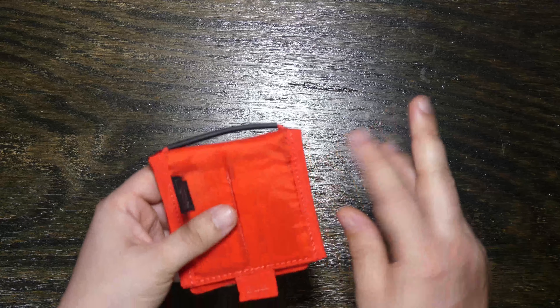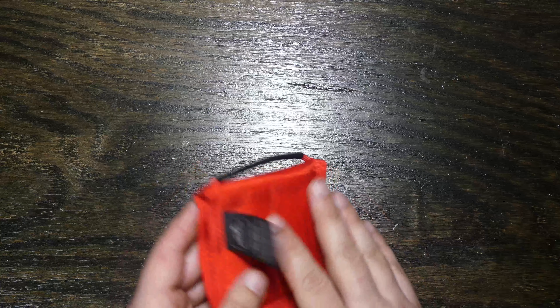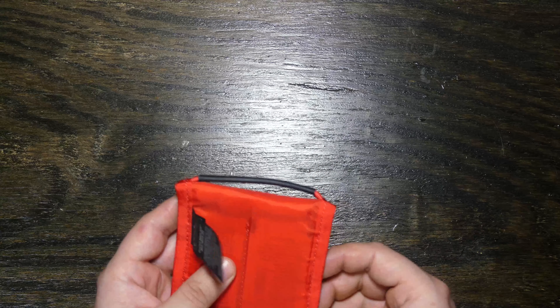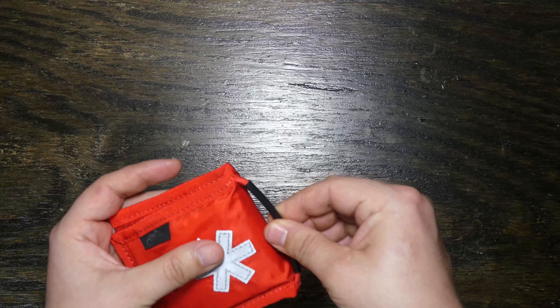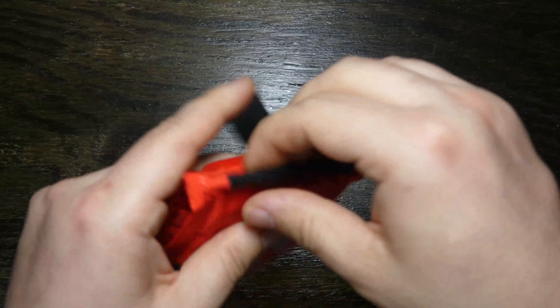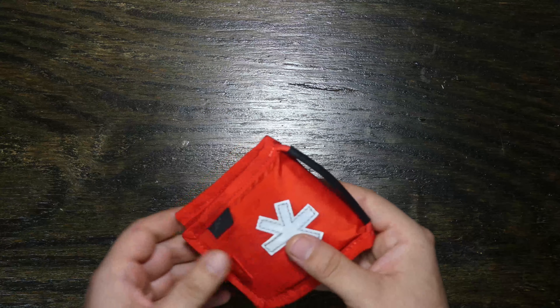The whole thing is made out of really nice nylon — I would almost say like parachute material. It's thin but you can tell it's pretty strong. The stitching on this is very well done. The 550 cord little handle across the top has some really thick shrink wrap on it, which makes a cool little handle to pull it out of a pocket, like out of a back pocket or out of a pouch in a backpack.